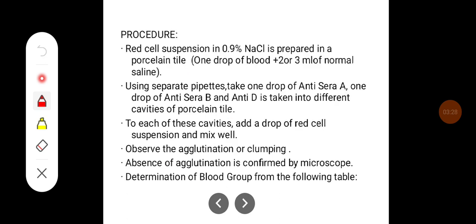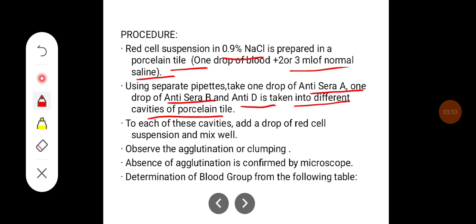The procedure is as follows: a red cell suspension in 0.9% sodium chloride is prepared — one drop of blood plus two to three ml of normal saline. Using separate pipettes, take one drop each of anti-sera A, anti-sera B, and anti-D into different cavities of a porcelain tile or slide. To each cavity add a drop of red cell suspension, mix it well, and observe for agglutination or clumping. Absence of agglutination is confirmed by microscope. Blood group is then determined from the following table.